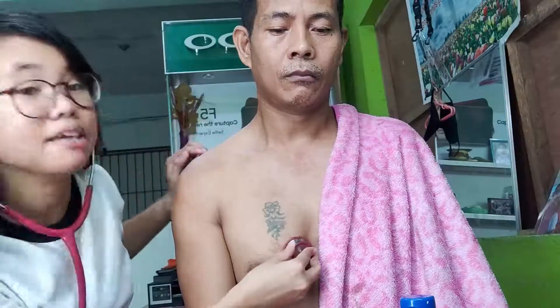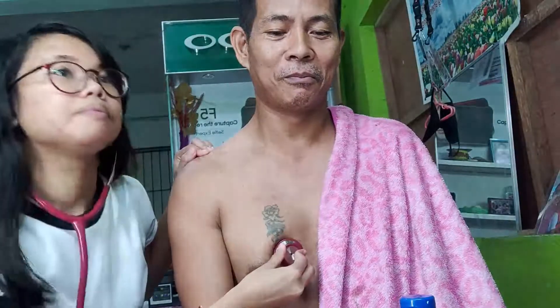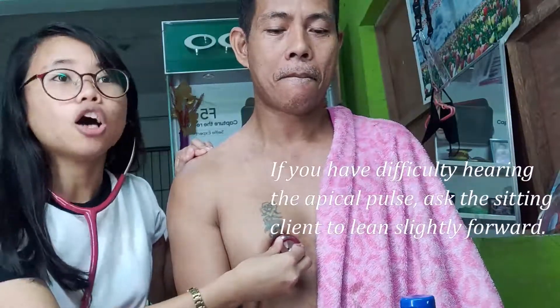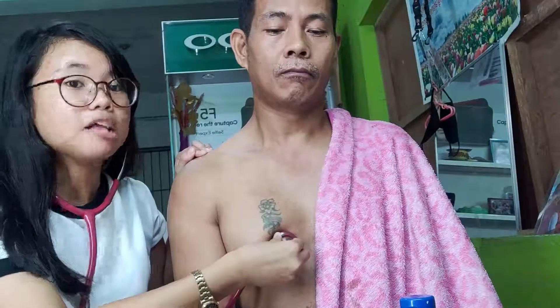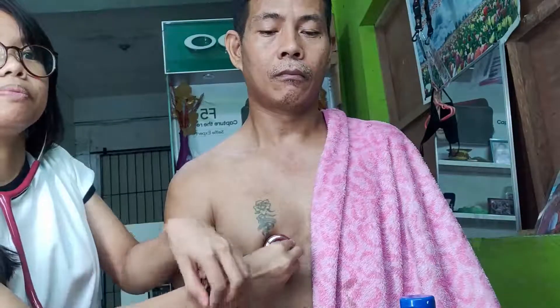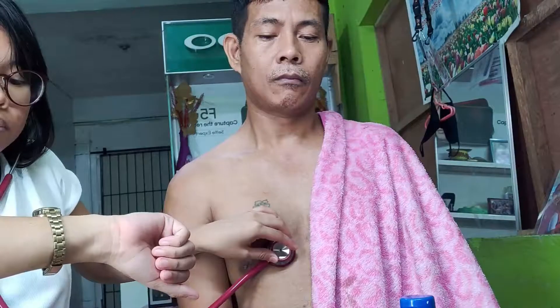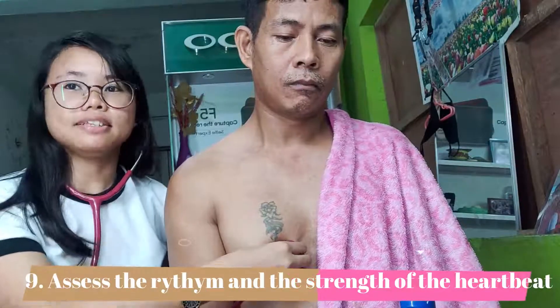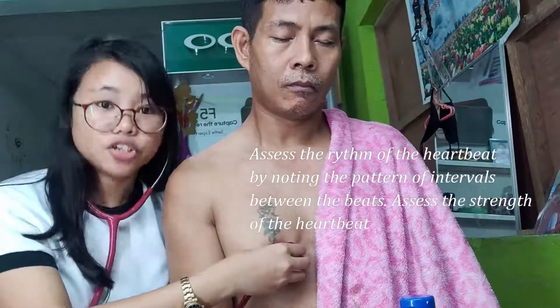This is the fifth intercostal space where the apical pulse is located. If you have difficulty hearing the apical pulse, ask the supine client to roll onto his or her left side, or the sitting client to lean slightly forward. Count the beats for 60 seconds using your watch. Assess the rhythm and the strength of the heartbeat by noting the pattern of intervals between beats and the volume of the heartbeat.